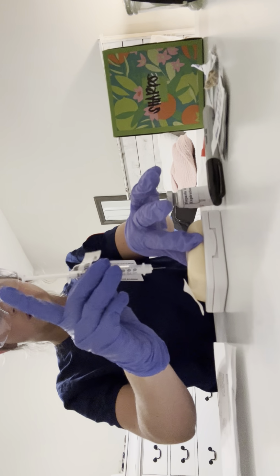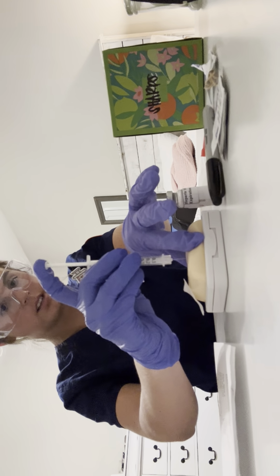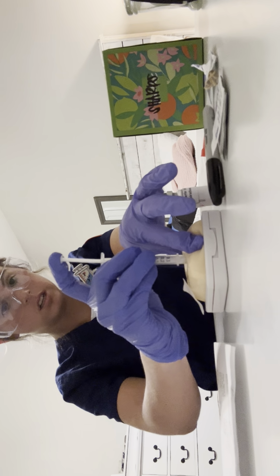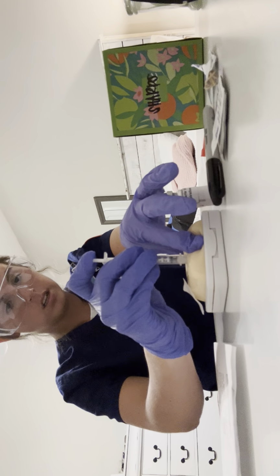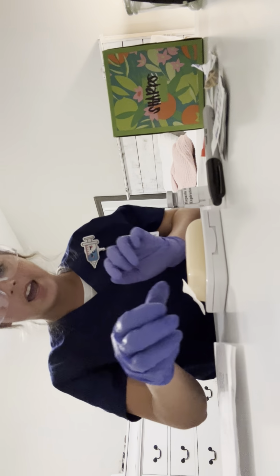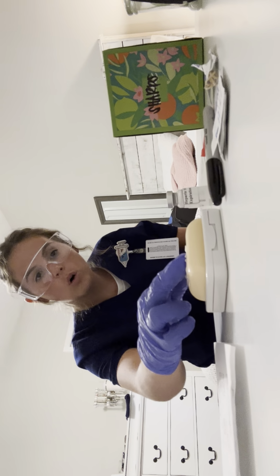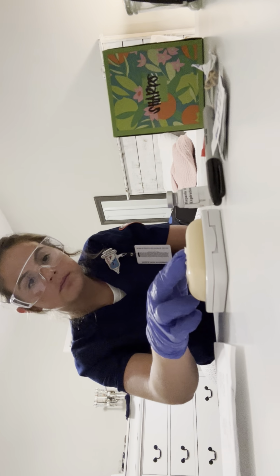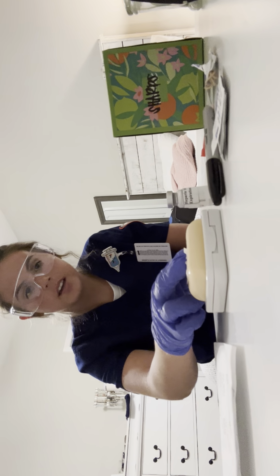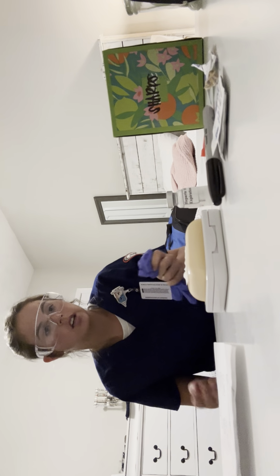spread, and I am going to inject. Or I'm going to pinch, and I'm going to inject. Perfect. I'm going to dispose directly into the sharps container, and I'm going to gently hold, and I'm not going to aspirate. I'm going to gently hold with light pressure. Okay. Then I'm going to discard my gloves and goggles.